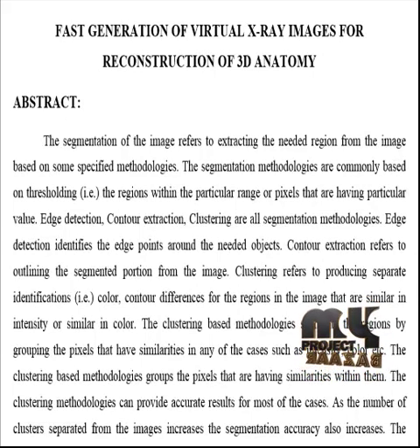The required regions are segmented from the pre-processed portions using the FCM algorithm. Each pixel in the images is checked on whether it satisfies the rules generated using fuzzy logic. If the rules are satisfied, the values are taken as similar groups. The number of rules generated is default and varies for different images. Each time the rule generation strategy changes in the FCM segmentation, the inverse transformation is applied to the input images and the clusters are obtained based on the generated rules. The image is segmented and the needed portions are identified.